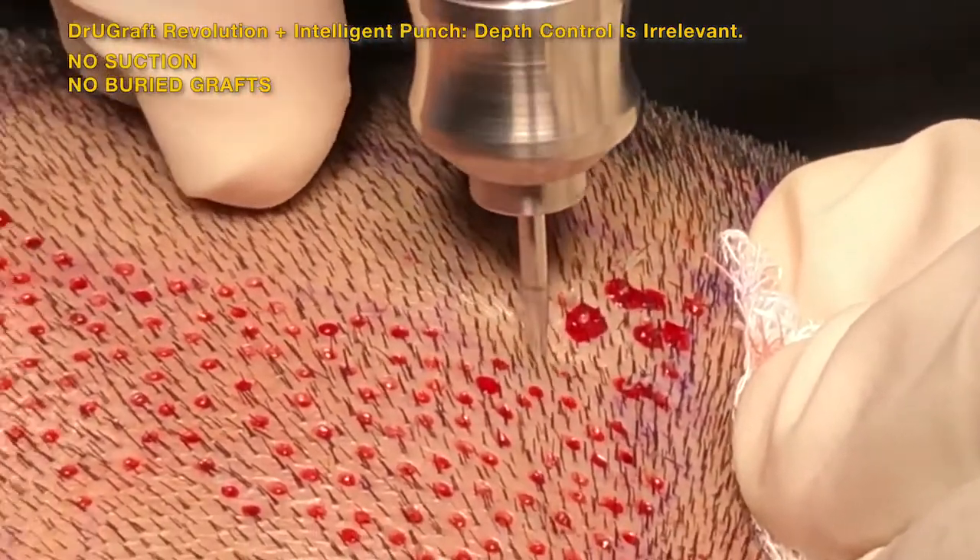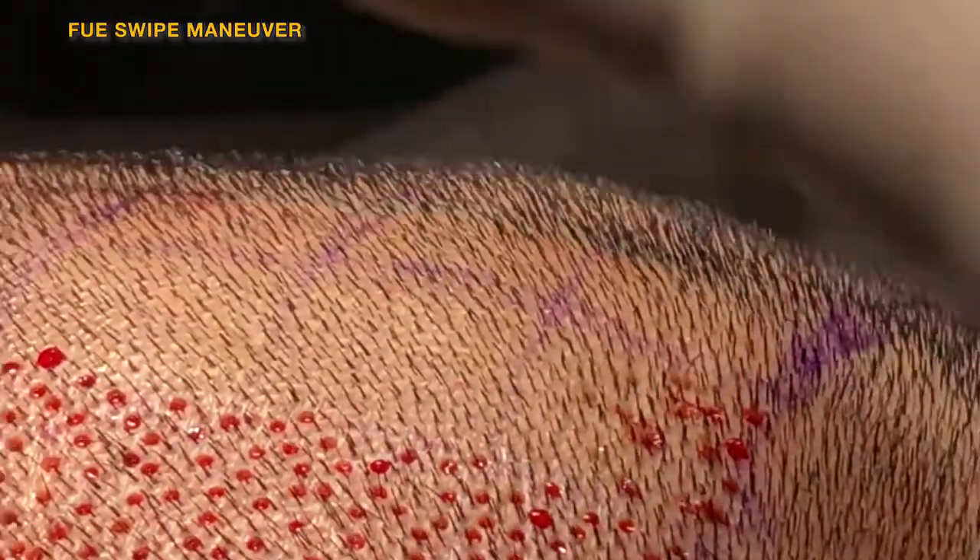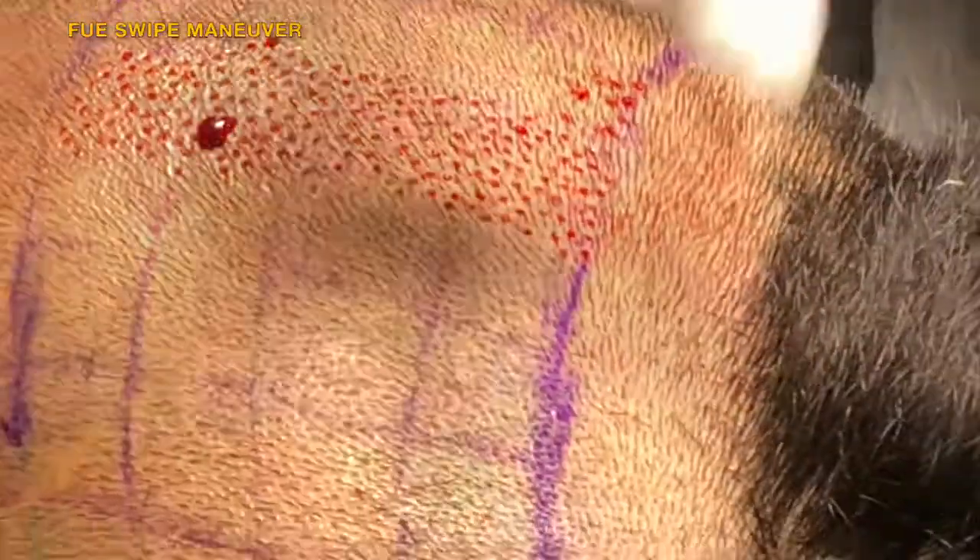Even when applying a large force and not being gentle on the back of the punch, the Dr. U Graft punch itself is the one that dictates how deep it should go and where to stop, making life much easier.